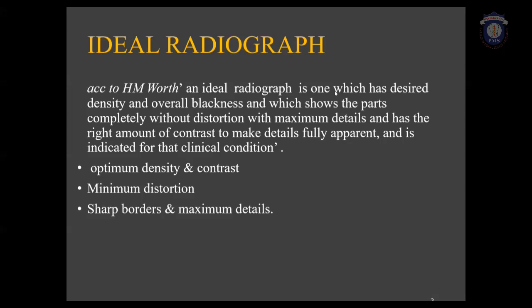So to summarize, we can say it has optimum density, optimum contrast, minimum distortion, shows all the sharp borders, and has maximum details.